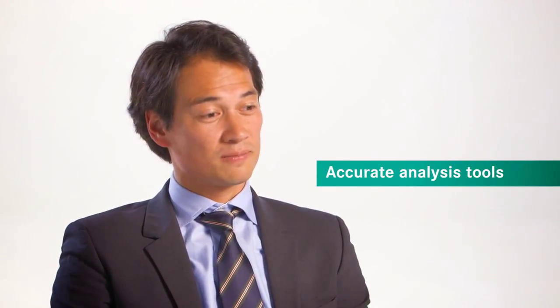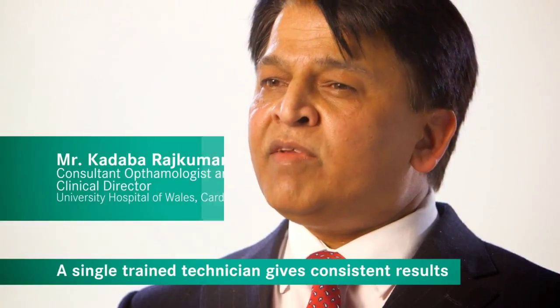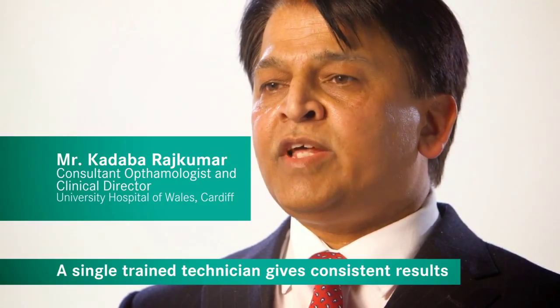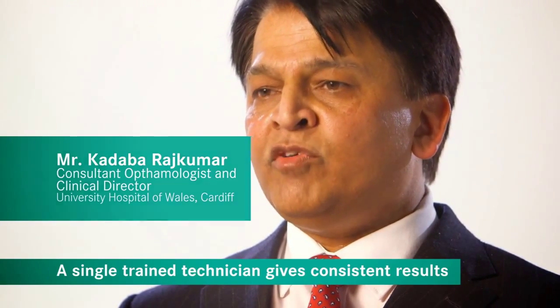The analysis tool of the Kowa camera is actually a very excellent tool that you should definitely use, because it gives you a more accurate impression of how the optic nerve head is developing, even more accurate than you can see it with your eye. And a good tip that I have there is really using the stereoscopic point of view to mark the outline or the contour of the optic nerve head. That helps a lot. I would certainly recommend development of a team where a single person is using the camera constantly so that you get consistently reproducible results.